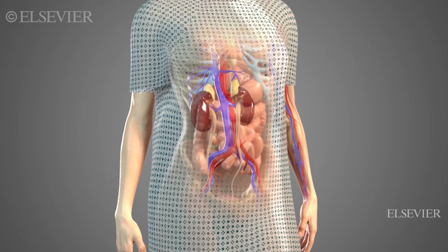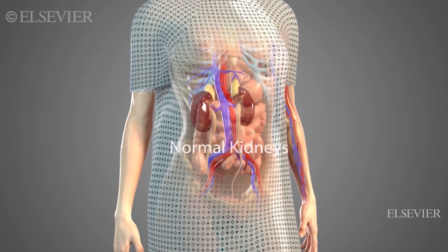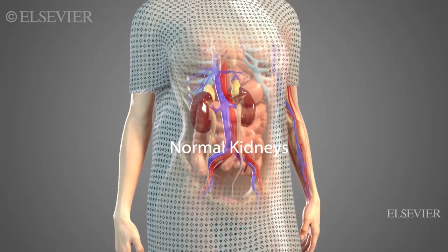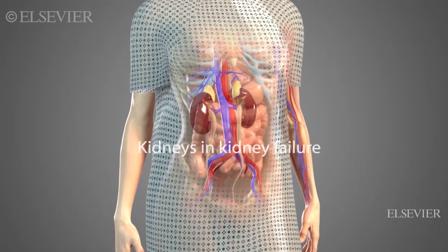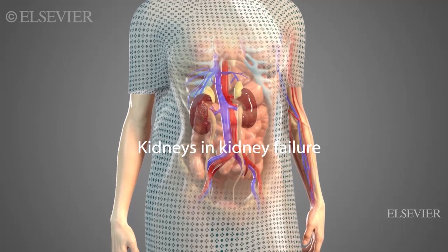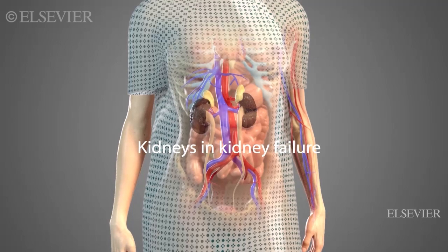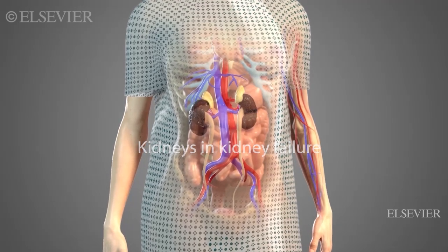For a patient with kidney failure or certain other conditions, dialysis can take over for the kidneys, removing wastes and balancing fluid, electrolyte, and acid-base levels. This procedure may occur through hemodialysis or peritoneal dialysis.